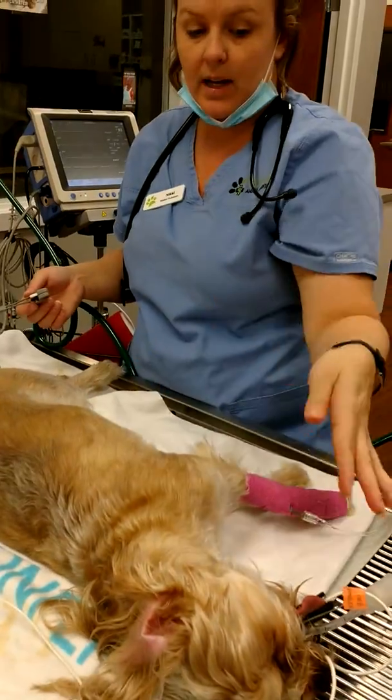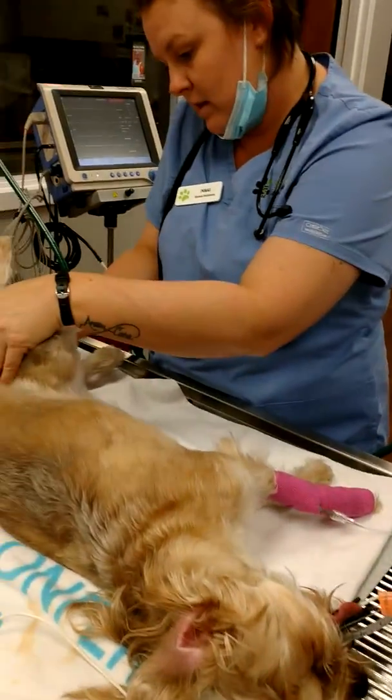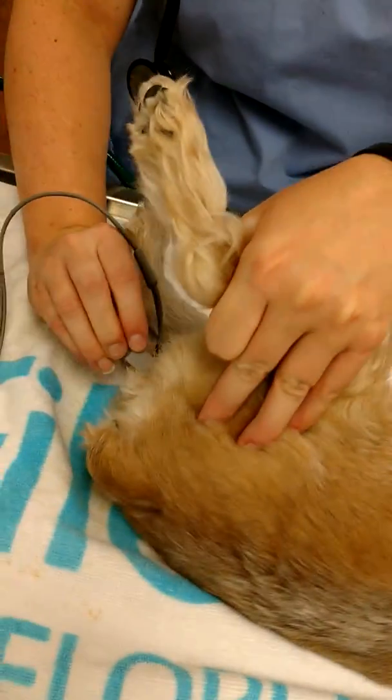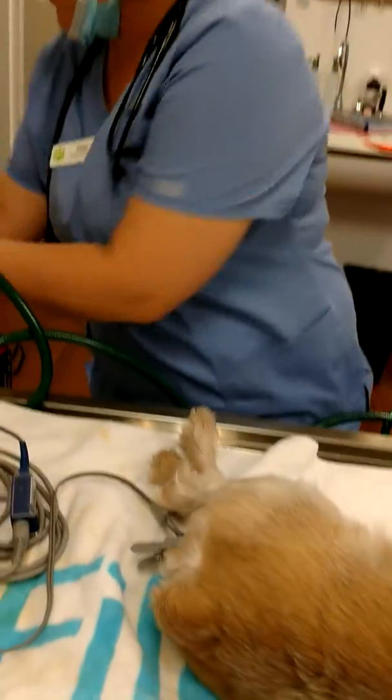This is going to show her oxygenation and her pulse rate. She's a dental, so the temporary pulse ox is on her tongue. But we're going to actually stick the one I'm going to use for the whole procedure on her vulva. That's the one I usually get started first.